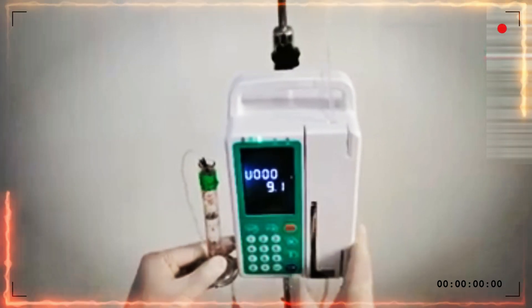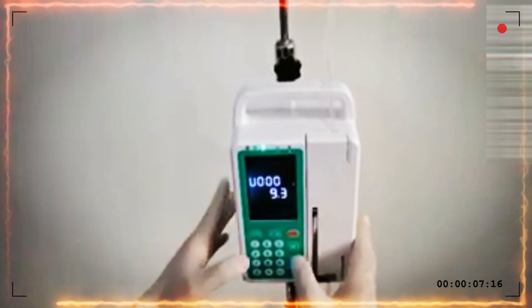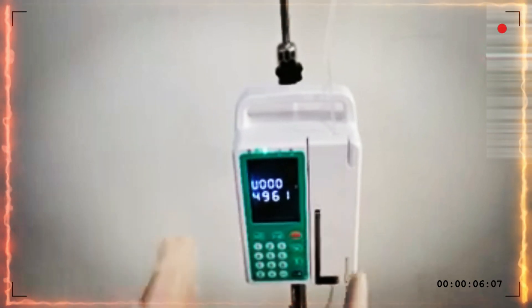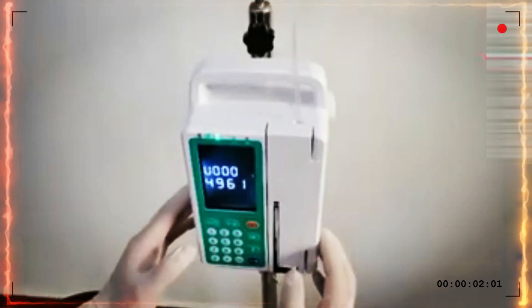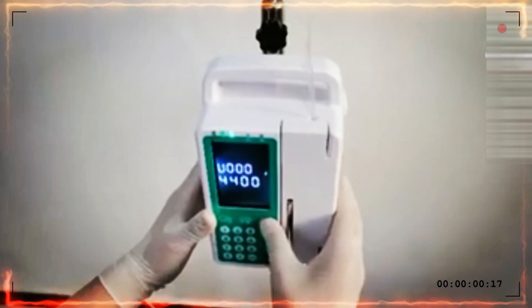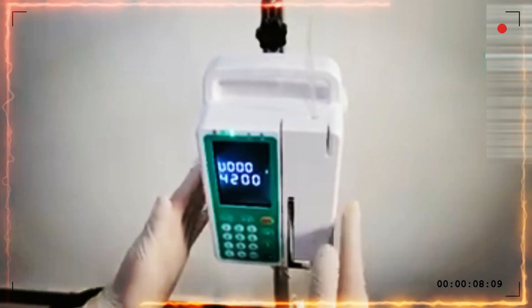Now we see it reaches 8, then press stop. The value shown on the pump is different from the cylinder value. We need to change the infusion pump value to match the cylinder value. Press 8, then press OK to finish the calibration for IV set brand number 1. If you want to set another brand calibration, long press the yellow select button. You can see number 2, number 3, and so on. The calibration process is the same as the first one.